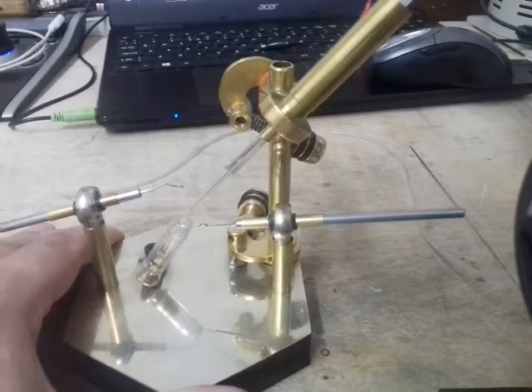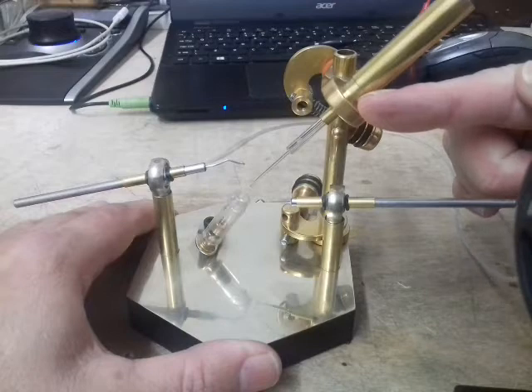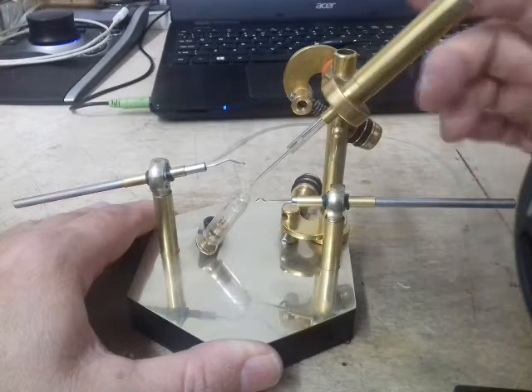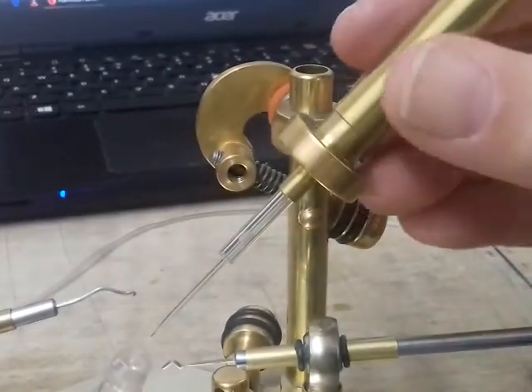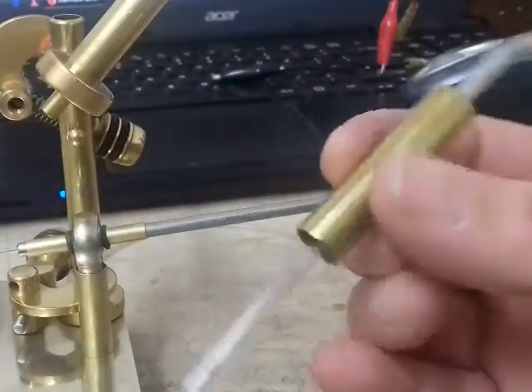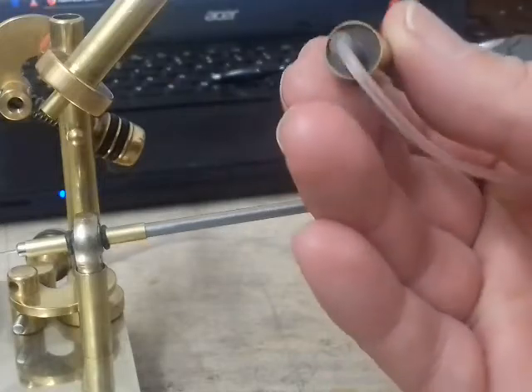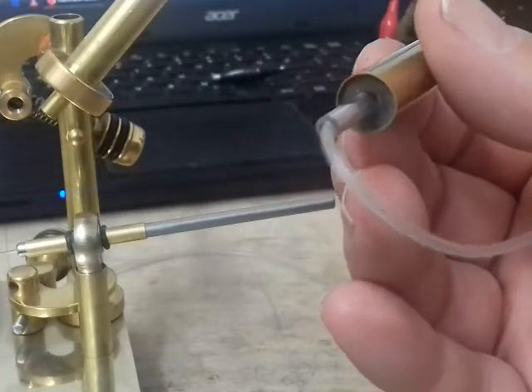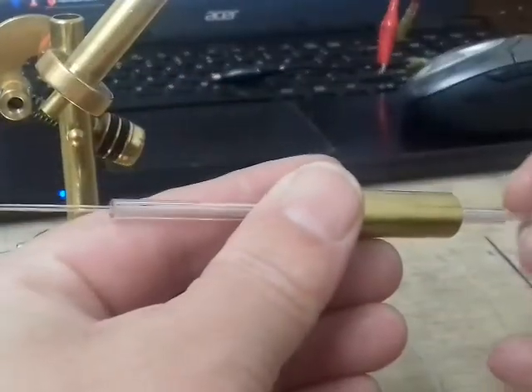So if I was going to make any more, this would be the one I'd base it on. Move the whole head rather than moving the needle itself, which makes more sense, and then just have a manual feed up and down with the tube there. You can see, if I take the actual tube out and show you, that's what it consists of, just a tube within a tube, and then at the top, rather than using a rubber O-ring, I've used some neoprene rubber there to keep it really firm so that the needle can't move, and I've retained the needle within a needle.